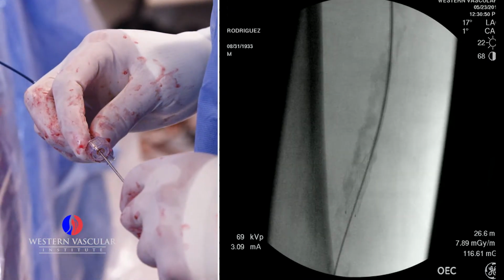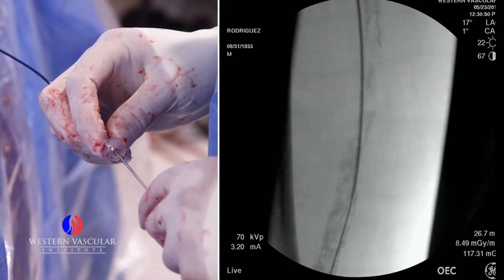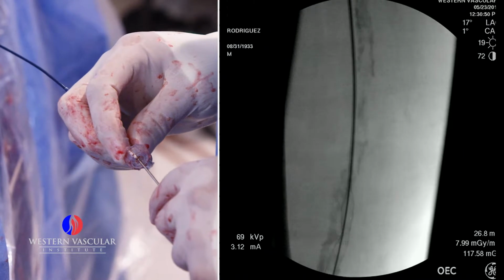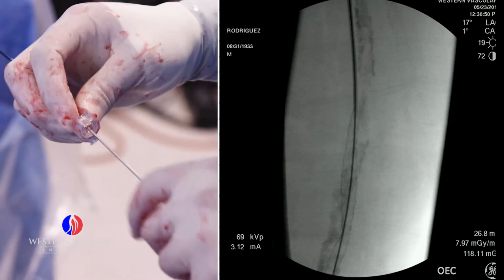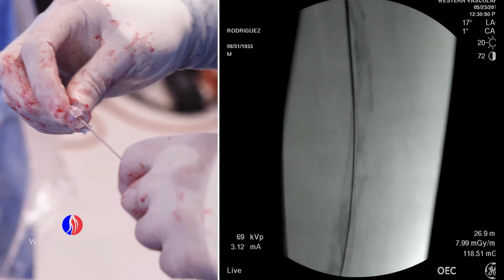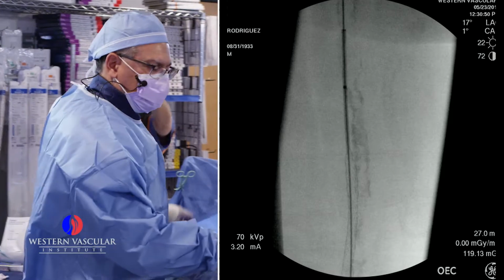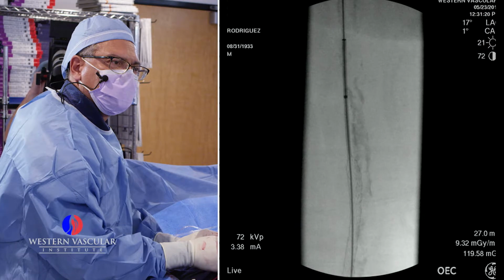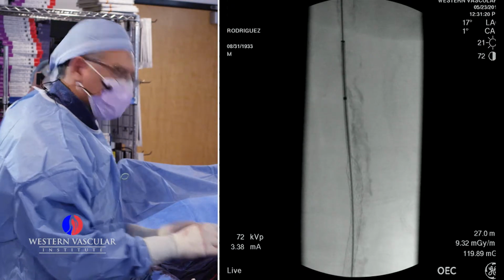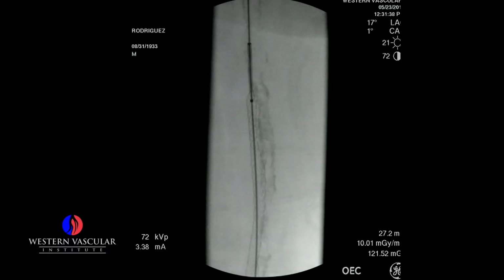And what I'm doing is uncovering the stent that has been constrained inside the tubing of the delivery system. So it's coming very nicely. Actually, it's opening very well there. Part of my stent is still inside the sheath, so I'm going to move the sheath back and continue the deployment. So we're going back to the lower portion right there.